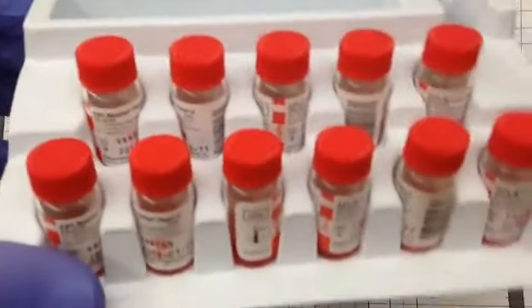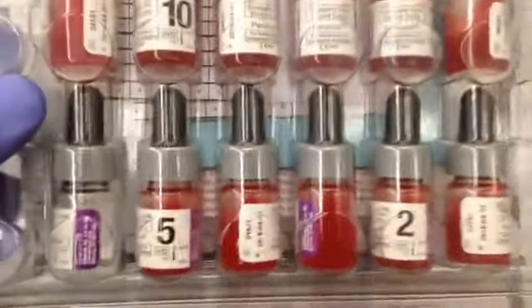In this video, I'm going to do my best to try and do a quick overview of antibody panels, what they are, how they work, and some features of them. Now, starting off, there are a couple different methods that you can use to perform an antibody panel. One is the gel method, and another is the tube method, and there are also instruments that do it now.